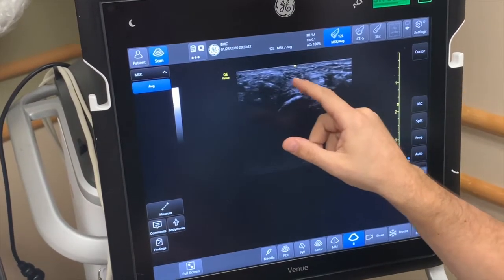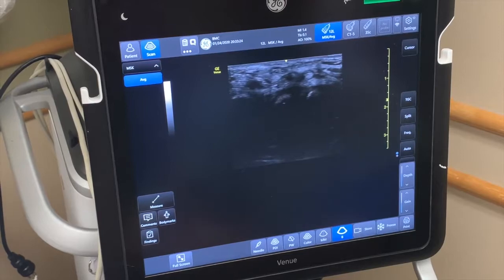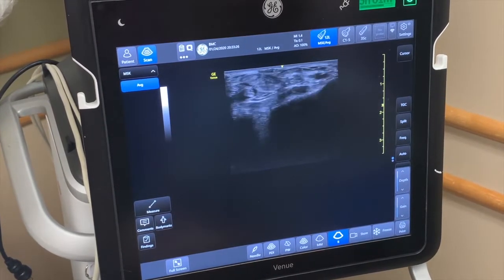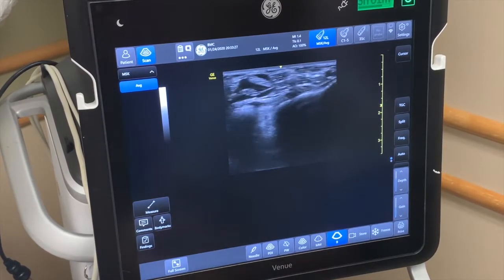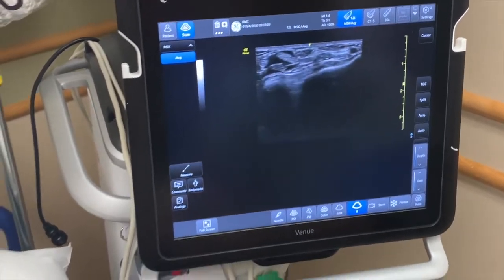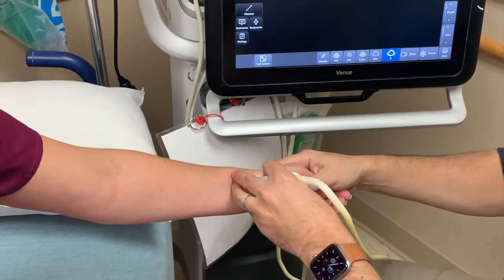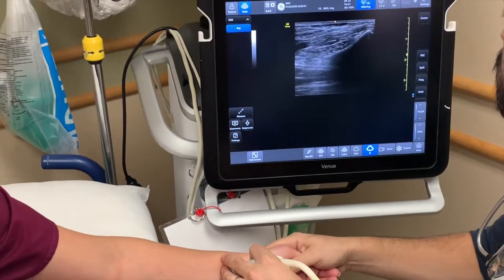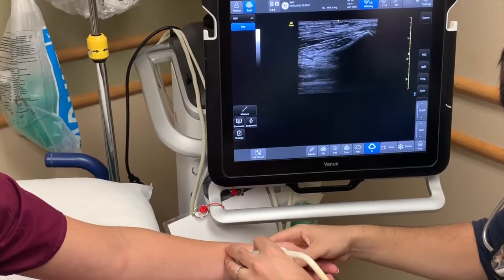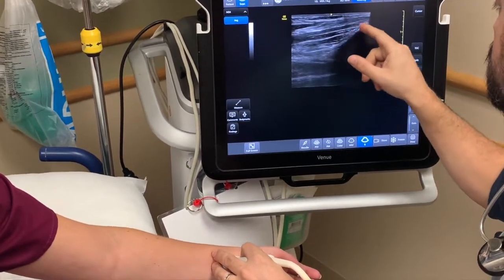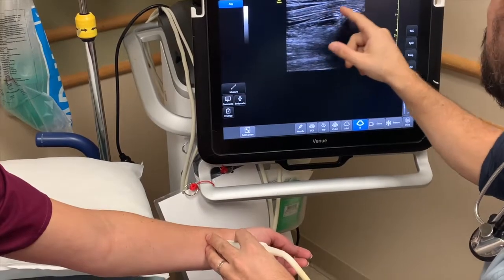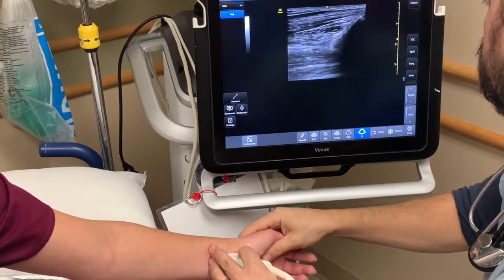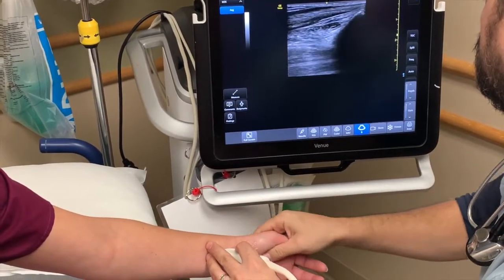All of this here is tendons. If she were to flex and extend her wrist, you can usually see some movement there. Especially if we were to go longitudinally, you can see the tendons moving.